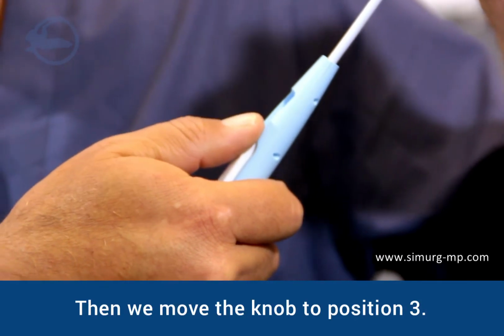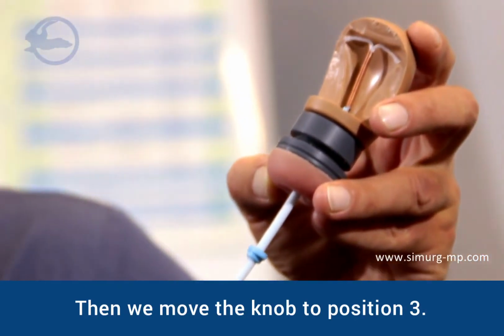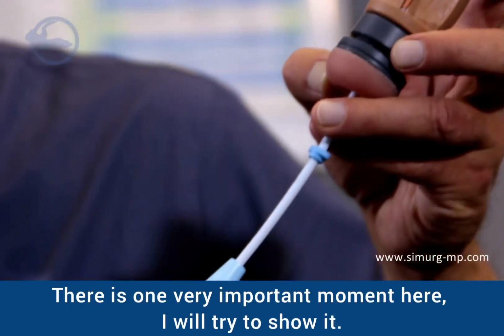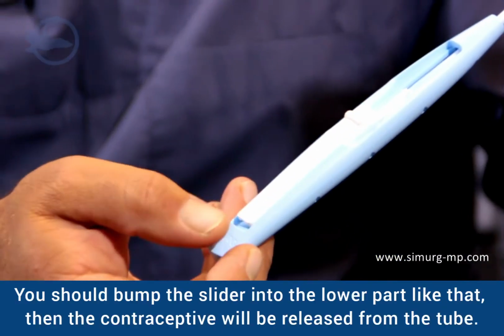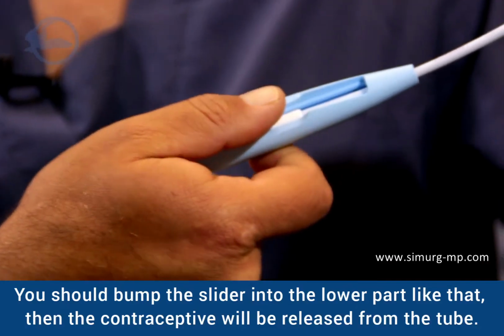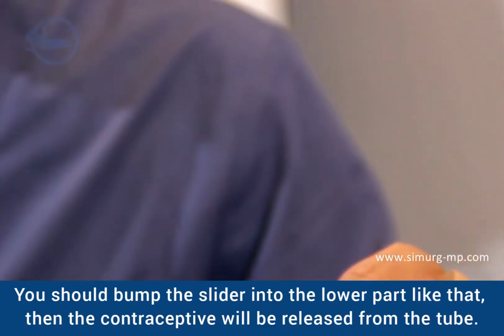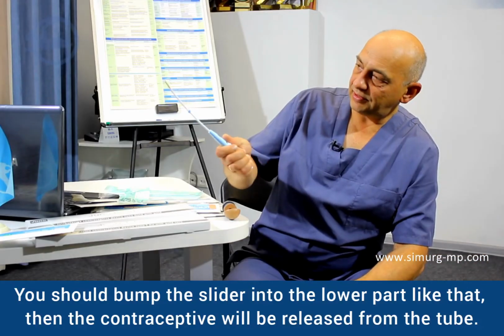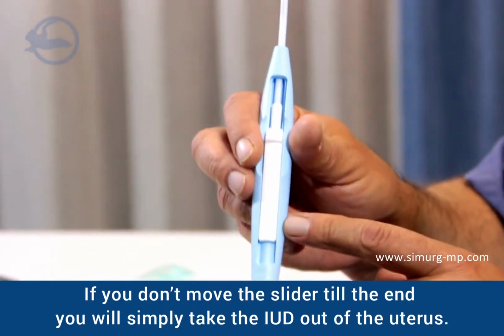Then we move the knob to position 3. There is one very important moment here. I will try to show it. You should bump the slider into the lower part like that. Then the contraceptive will be released from the tube. If you don't move the slider till the end, you will simply take the IUD out of the uterus.